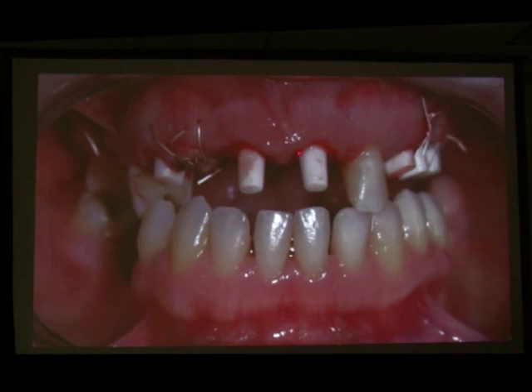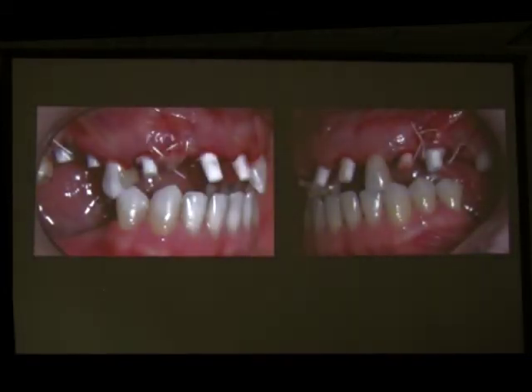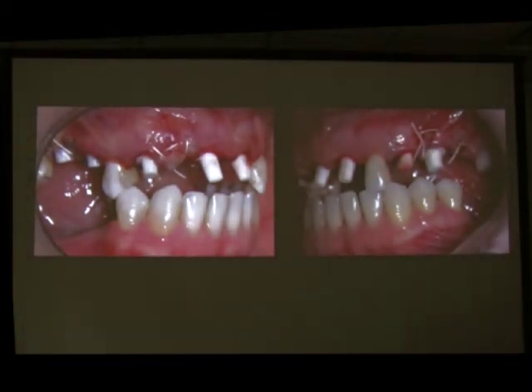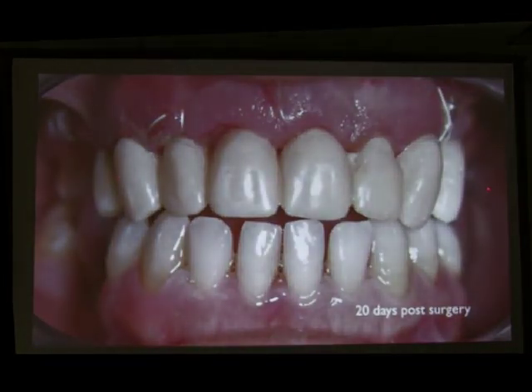The margins of the implant are not deeper than 1 millimeter, and we don't want to go deeper because if we have something exposed, we will prep the margin. So we screw the implants almost until there is a stop, and we prep this tooth. And we make a one piece bridge on top of the implants, splinting teeth and implants.